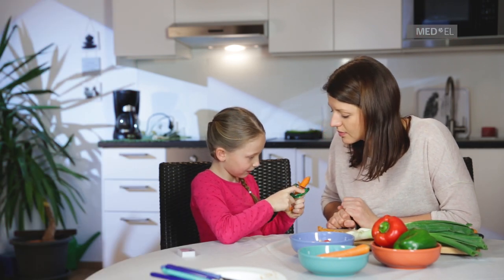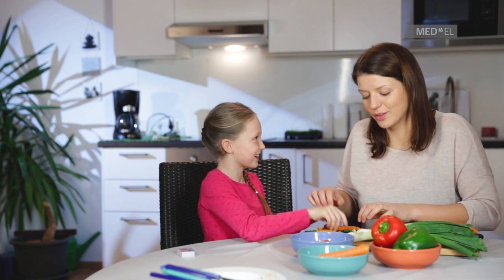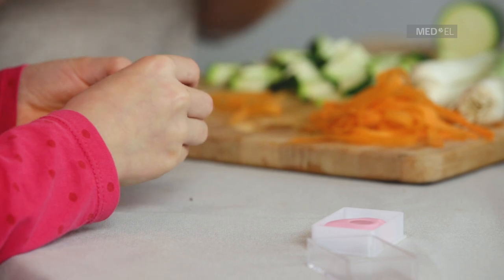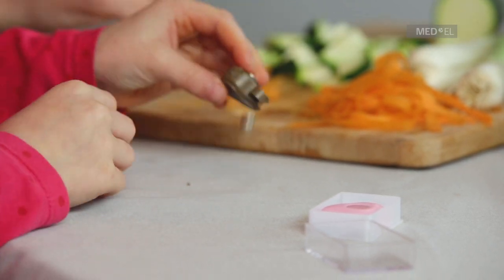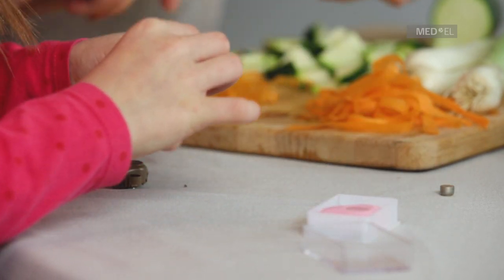Changing the battery of the Adhere Audio Processor is very straightforward. Take off the audio processor from the adhesive adapter. Open the audio processor's battery compartment and remove the empty battery.